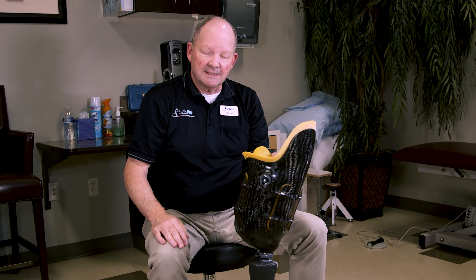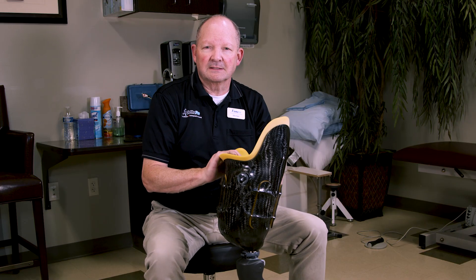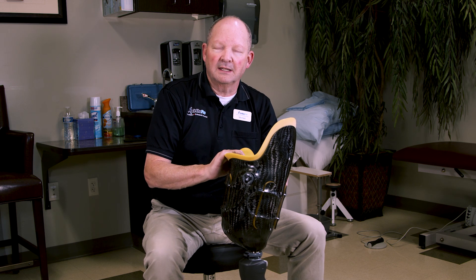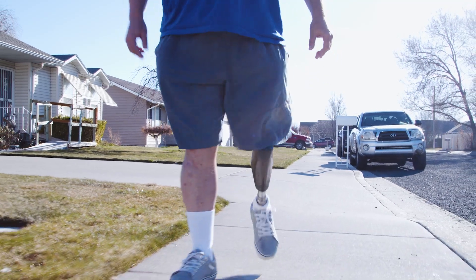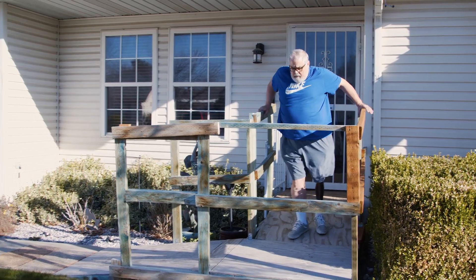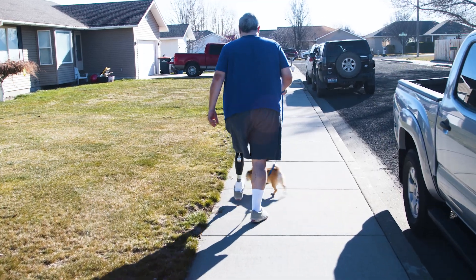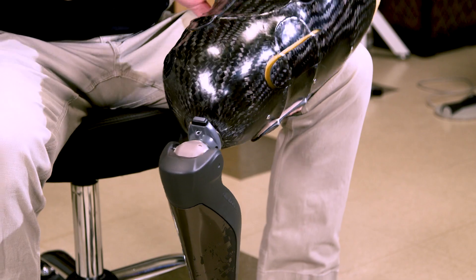The other feature of this particular prosthesis is a microprocessor-controlled knee. One of the most important things to people with this level of amputation is we want to mitigate the chance of having a fall. Microprocessor-controlled knees help reduce those incidences because they can sense when it's the best and appropriate time to bend at the knee. It helps the patient recover from a stumble, and it also knows when it's not a good time to bend. Being able to appropriately know when to bend and let the patient swing through is most important.